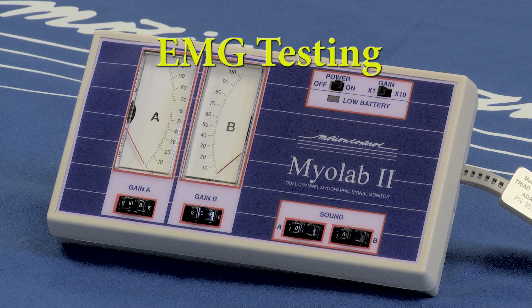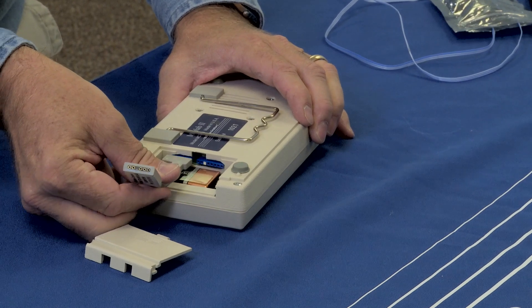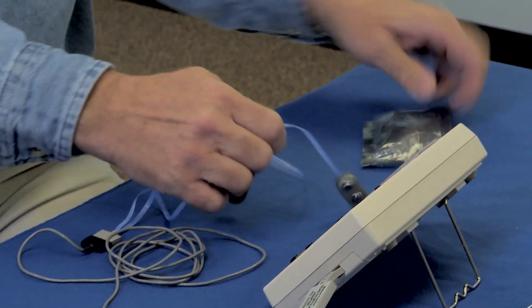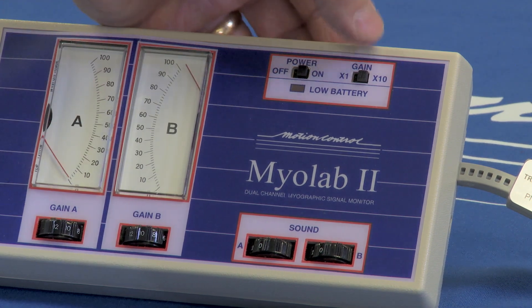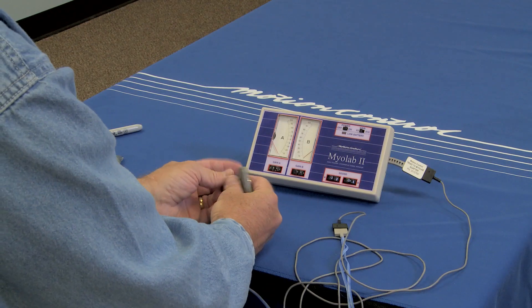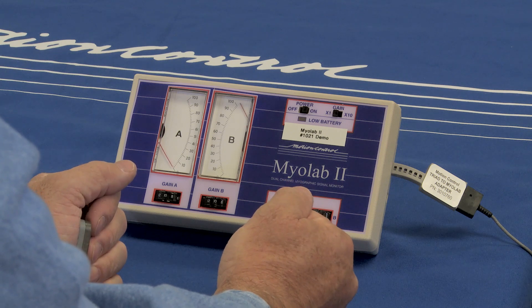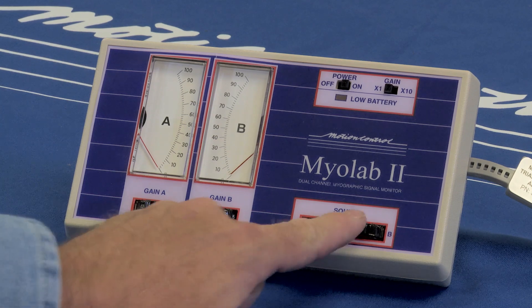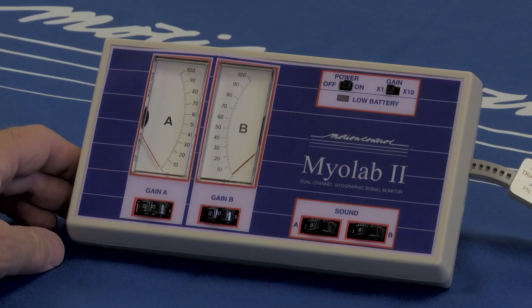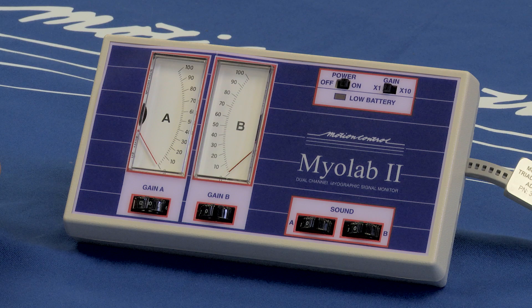For EMG testing, we use the Motion Control Myolab 2. Ensure that the battery is fully charged before operating the Myolab. For triad preamps, install the triad adapter plug and attach the preamps to the adapter. Turn on the Myolab and set the gain switch to the x1 position. Set the A and B electrode preamps to 3. By placing the electrode on the thenar muscle of the thumb and flexing, identify the A and B channel electrodes. The audio settings on the Myolab can also be used as a biofeedback device to monitor the signal. Set the A channel gain to 10 and the B channel to 0. The Myolab is now ready to evaluate EMG sites.